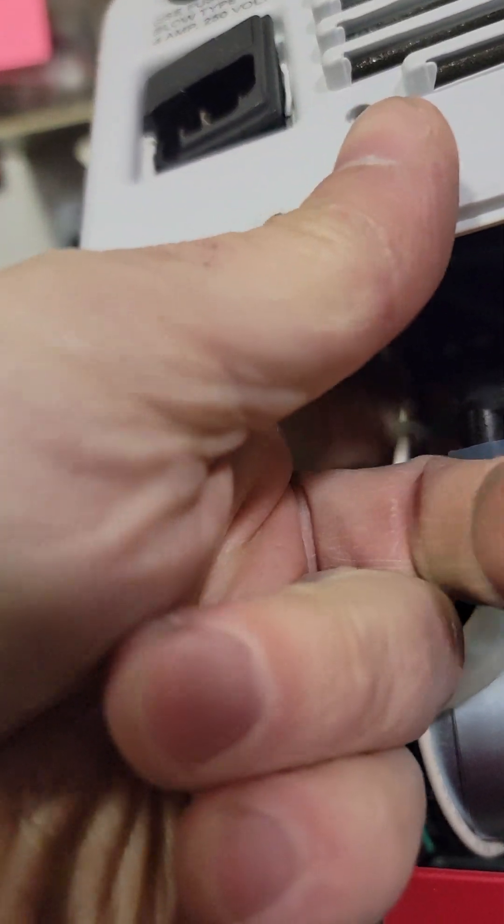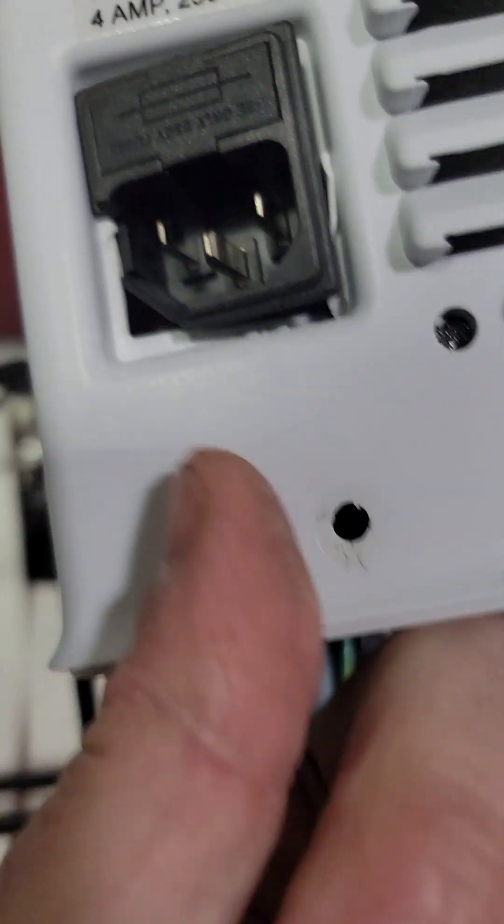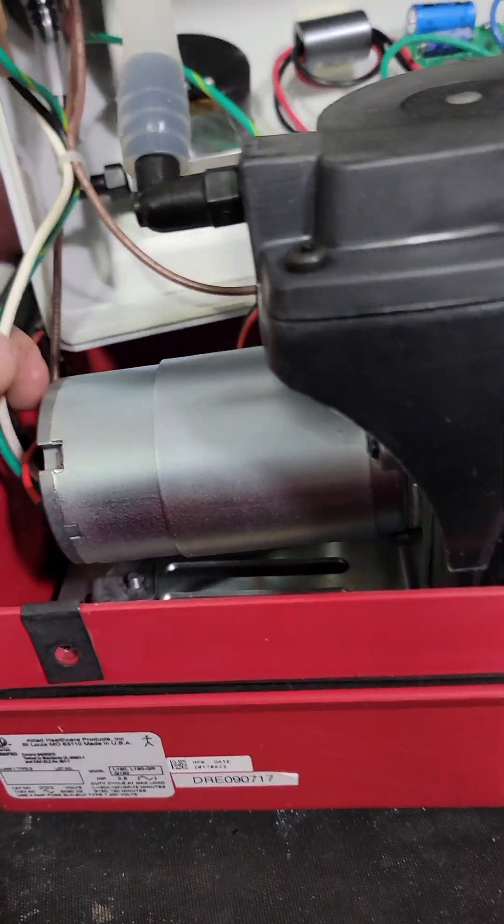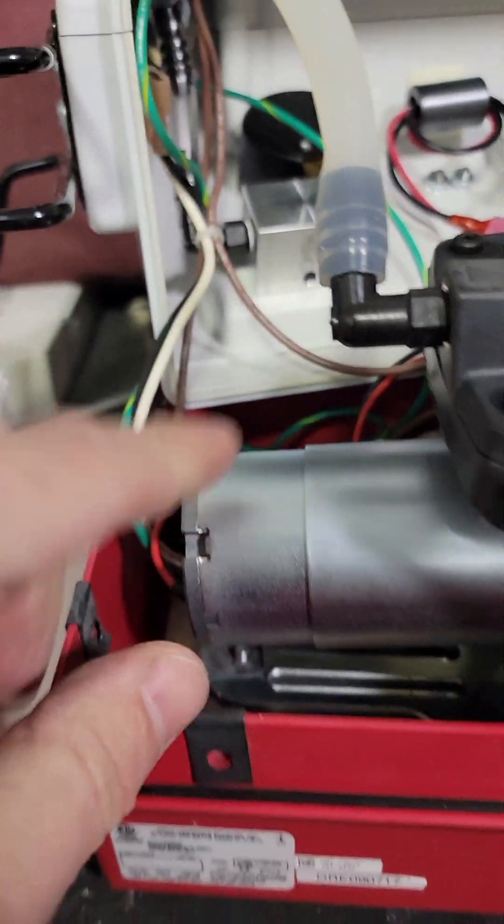Pull your power entry wires right here, just off the back of power entry. Mine is broken so that's going to go on the estimate anyway. Move them around the motor and now you can pop the thing in — you have much easier access.